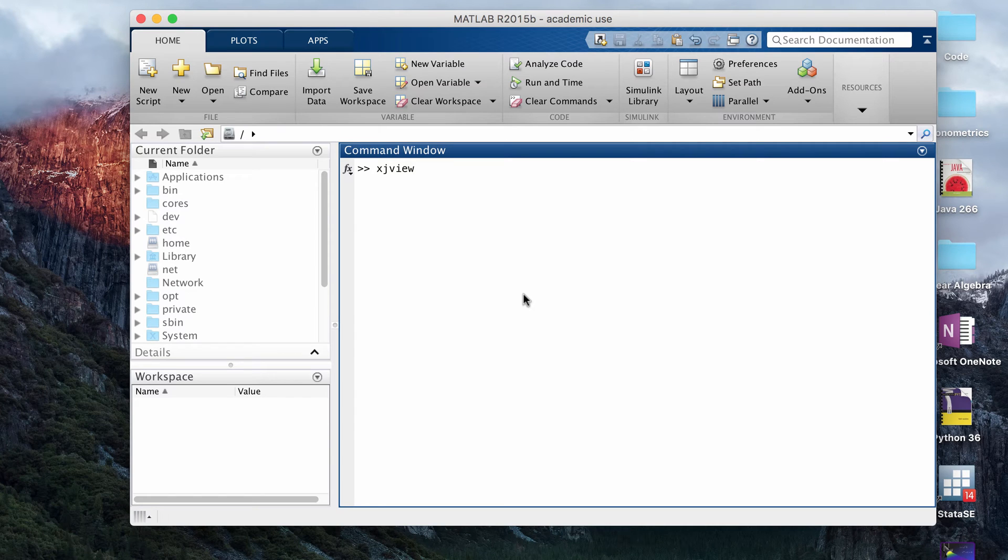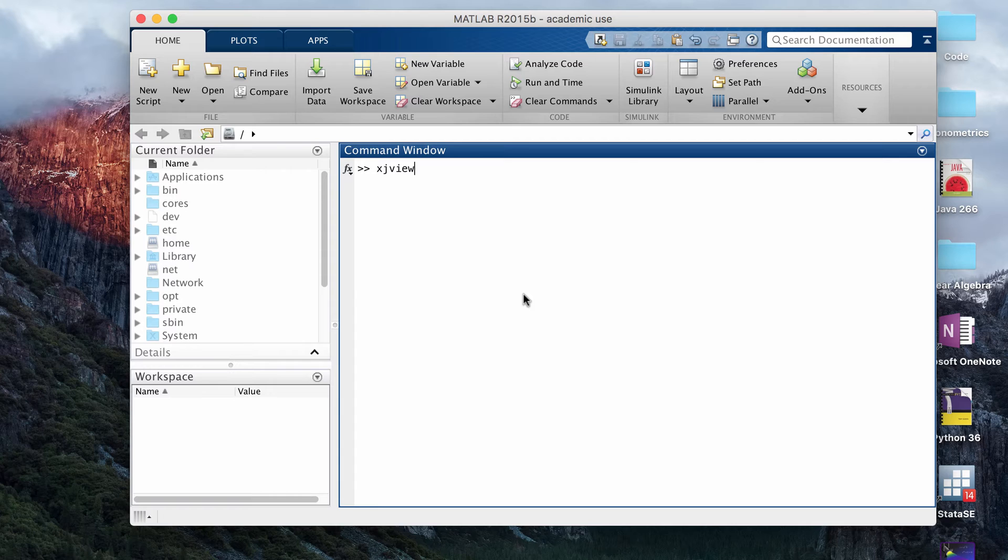Hey guys, in this video I wanted to talk about how to visualize the results of VBM using XJView. XJView is a free program that if you go to its official website you can download for free and use it in MATLAB.